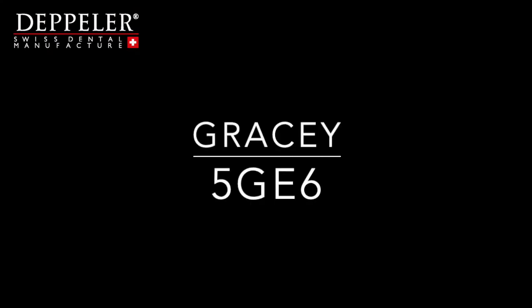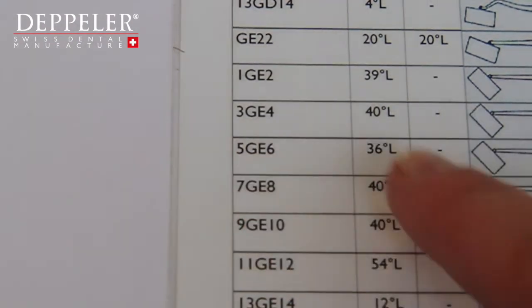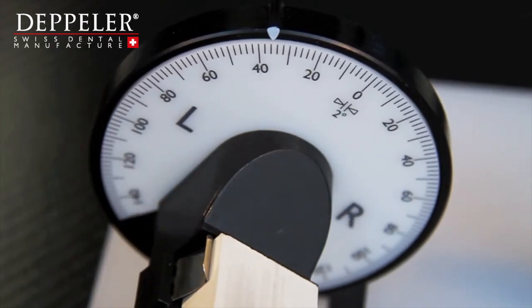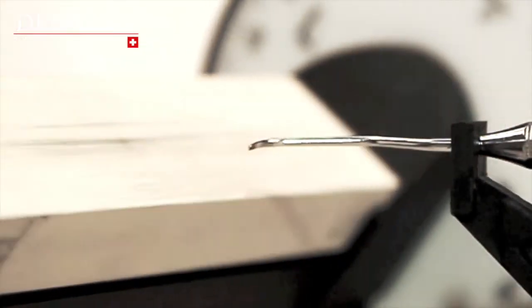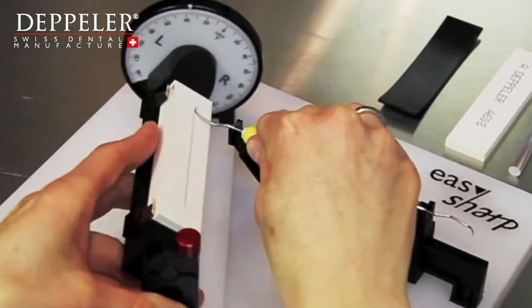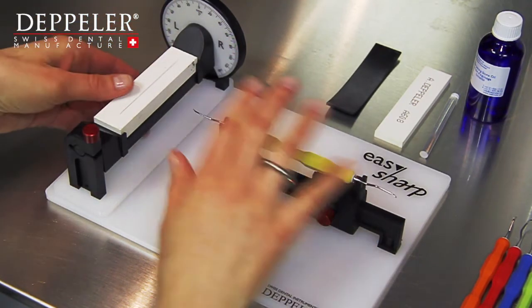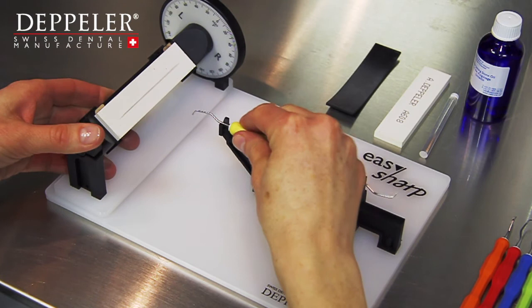Now let's take a Gracey 5-6 curette. The method is the same. Find the corresponding reference on the list, adjust the angle, check the blade's position on the stone and the movements to be performed. Always bear in mind that you want to follow the curve of the blade. The sharpening of a Gracey 5-6 curette is carried out in less than 30 seconds. To save time, sort your instruments by item number and sharpen the same instrument one after the other to avoid having to adjust the angles too often.